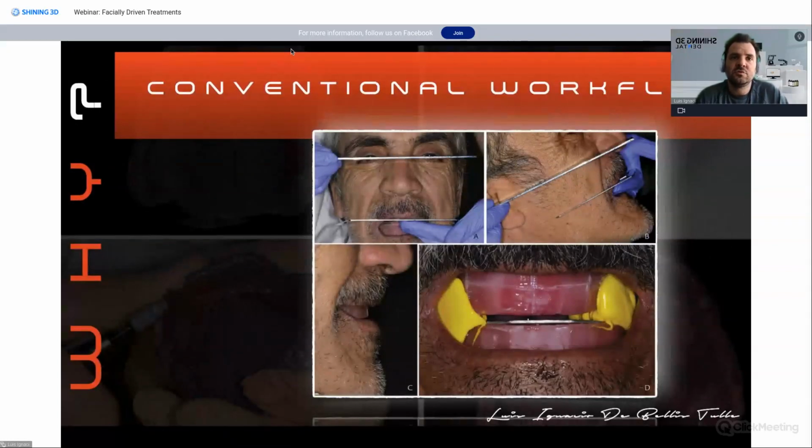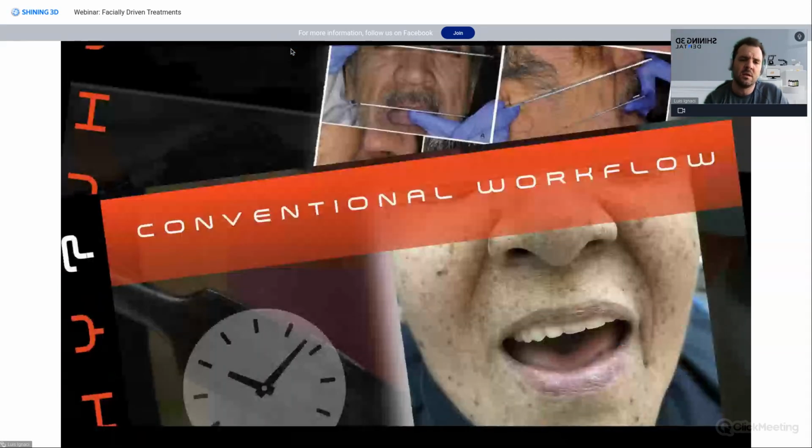In the early 2010s, Christian Coachman introduced a very nice workflow for the DSD, where we had to take some pictures, place those pictures with a ruler, check different aspects, and send those aspects out to our local lab. And it was a great improvement. But we are still having a problem. Some blocks of our chain might be missing while we transfer our stuff from our dental practice to the local lab.